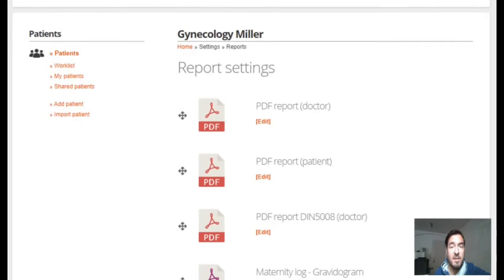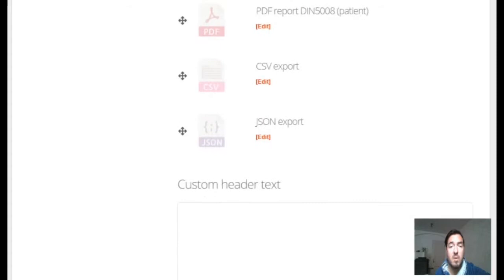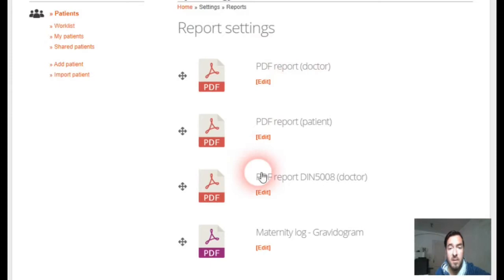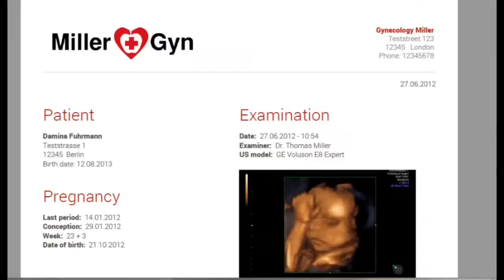If you go to report settings in FetView, you can find all the possible reports which can be generated within FetView. Most of you will use only the three main reports — let me show you which ones they are.